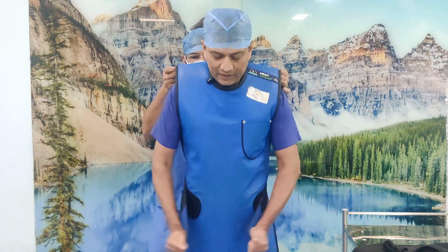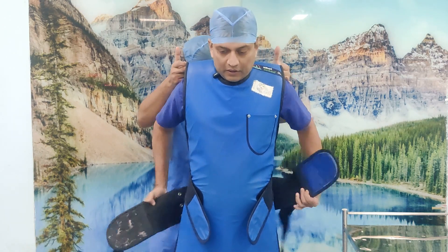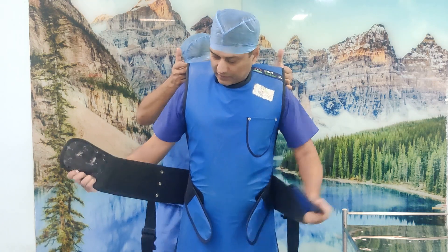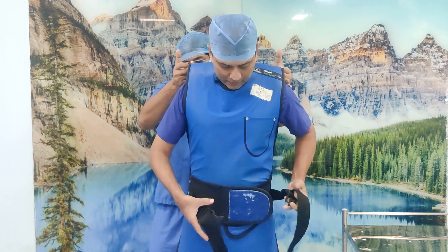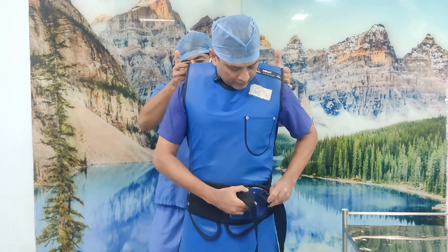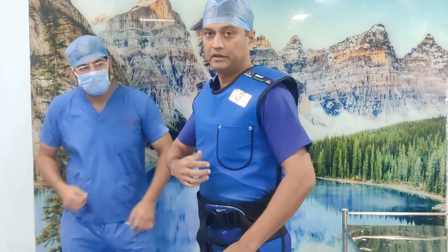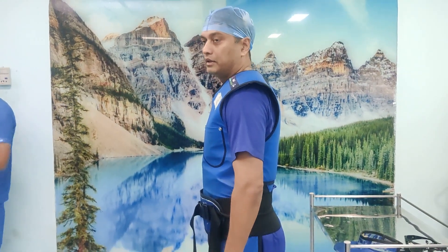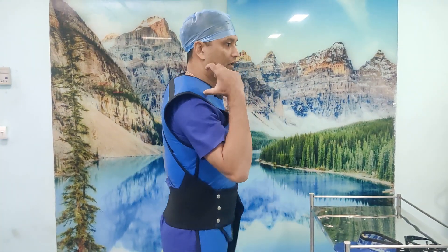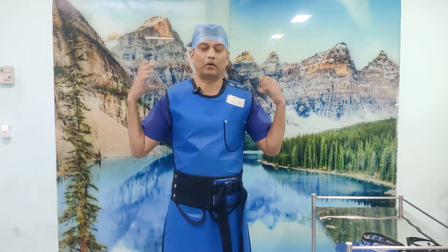As Akash has lifted it up, I have put this strap tight. Now I am using this belt. Akash is lifting it up and I am using this belt, and once this belt is done and I have buckled and tightened it - just leave it Akash. Can you see this gap? There is a huge gap between my shoulders and the lead apron - same here, a huge gap between the lead apron and my shoulders. So effectively I am wearing it but I don't feel the weight on my shoulders.